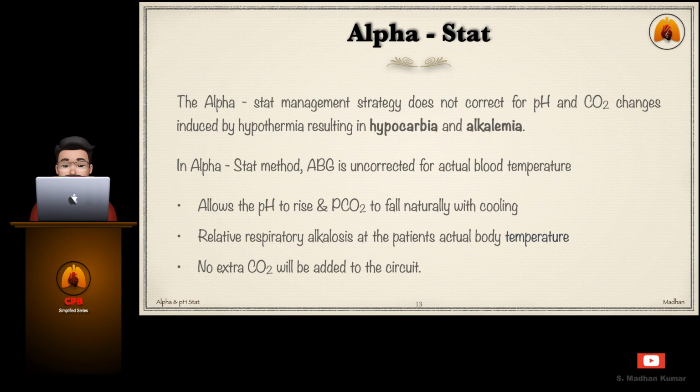This allows the pH to rise and pCO2 to fall naturally with cooling. There is relative respiratory alkalosis at the patient's actual body temperature. No extra carbon dioxide will be added to the circuit.